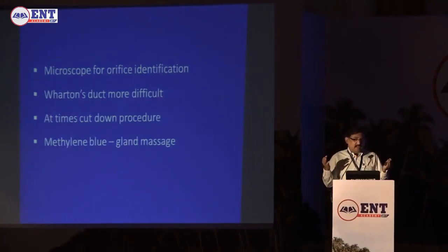That's why there is no fogging, but there is so much debris and other things coming and clouding. But you have to do everything underwater. Only water dilates the duct and allows you to see. If you don't irrigate with water, you lose vision. Okay?